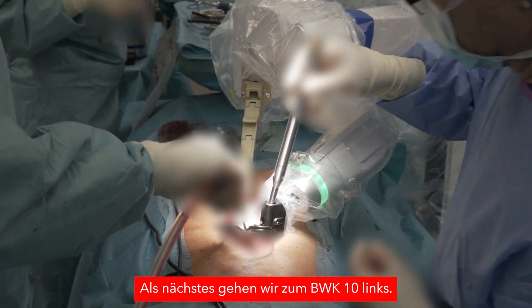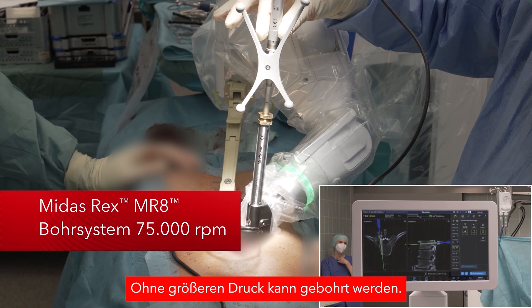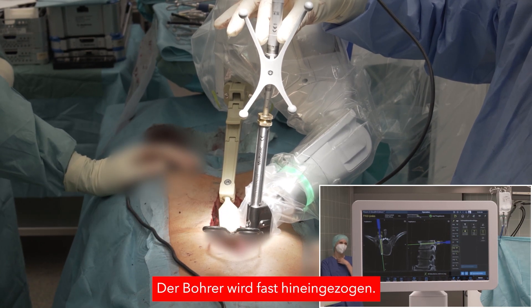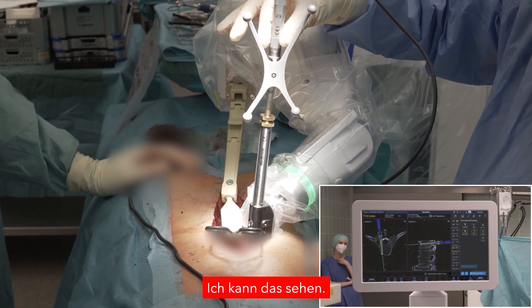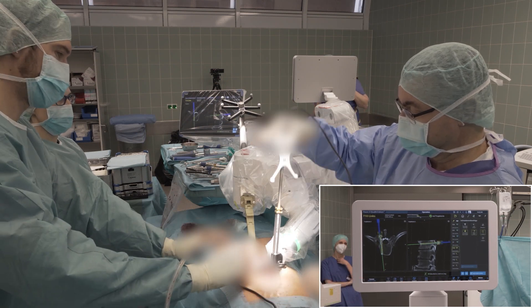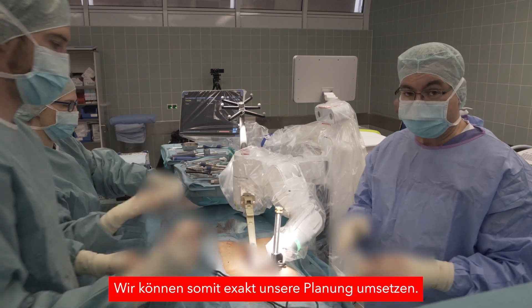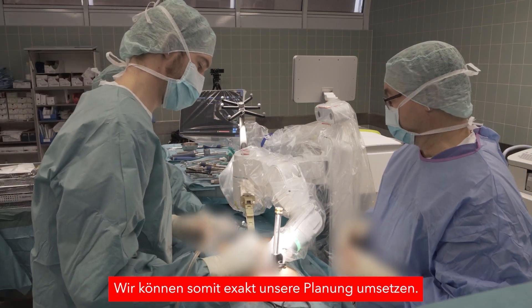We are going now on T10 on the left side. You can just easily apply it without a lot of pressure — it goes in, it sucks in, and I can use it with just two fingers. There is no chance that skiving occurs, so we can execute exactly the hole we have planned.